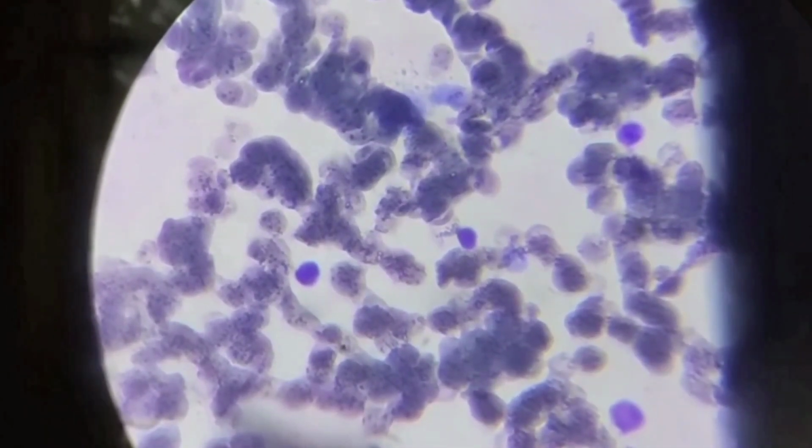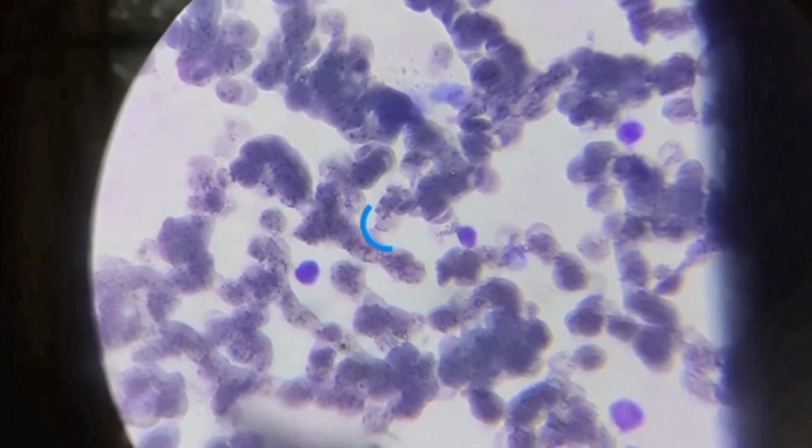Yes, so this is the 100x, or we can say the oil immersion 100x objective lens. So total magnification is 1000x, and here we can see the cells. So this is actually a lymphocyte, and these all cells are actually RBCs.